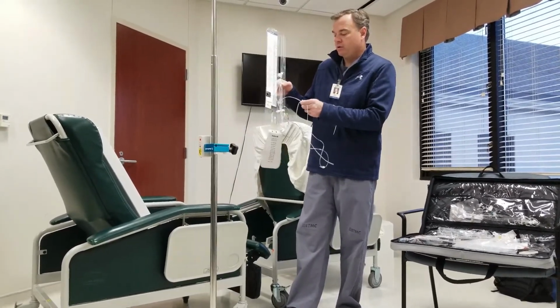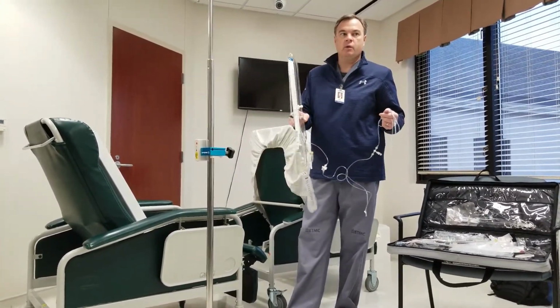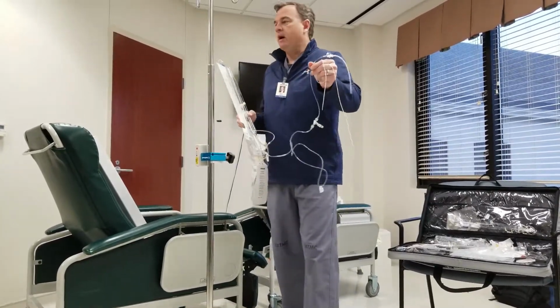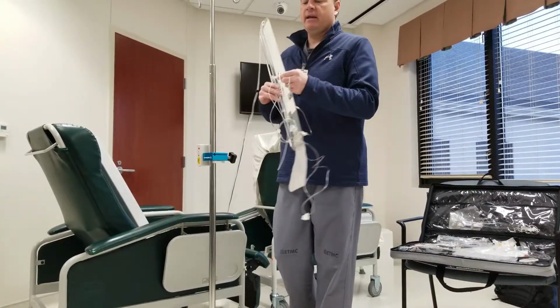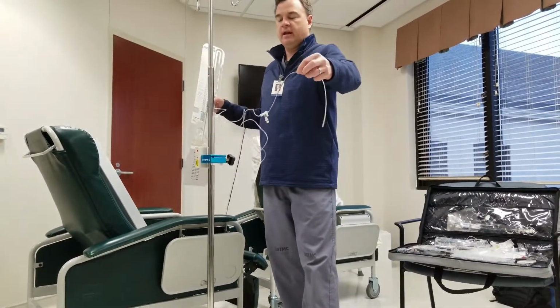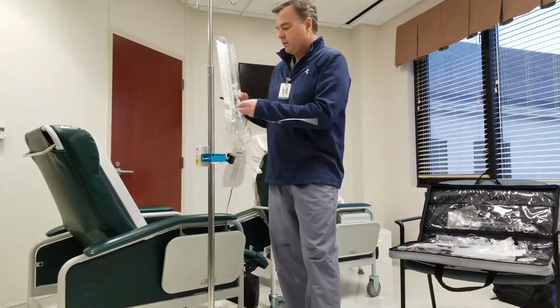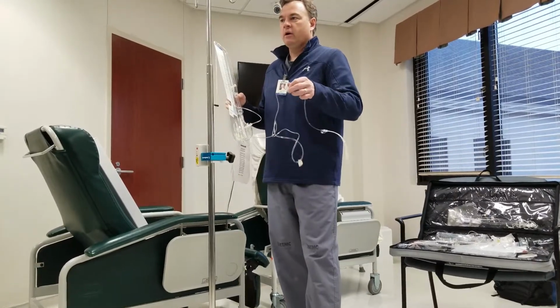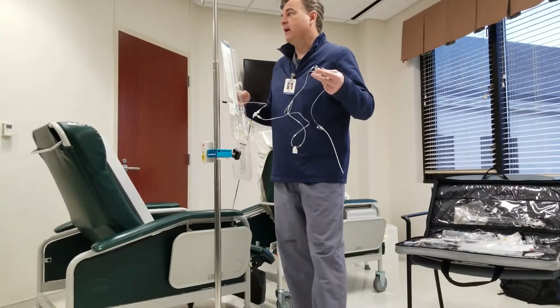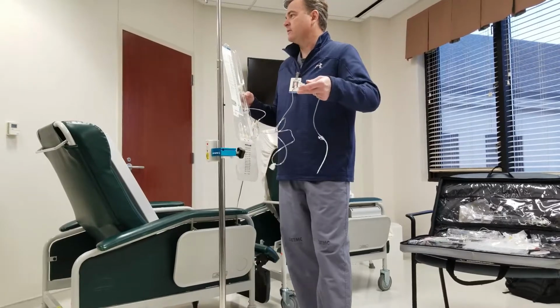One other thing to note, it's a little bit easier for you guys to manage, particularly because it's away. It's going to be at the waist of the bed. But this blue line was designed to jump out at you, and this is a CSF pathway, right? It should look different than anything else, because all of these stopcocks, whether it's right here or right here, are off limits. Occasionally you'll have somebody say, I want to send something to the lab to check for meningitis, or whatever else they're looking for.